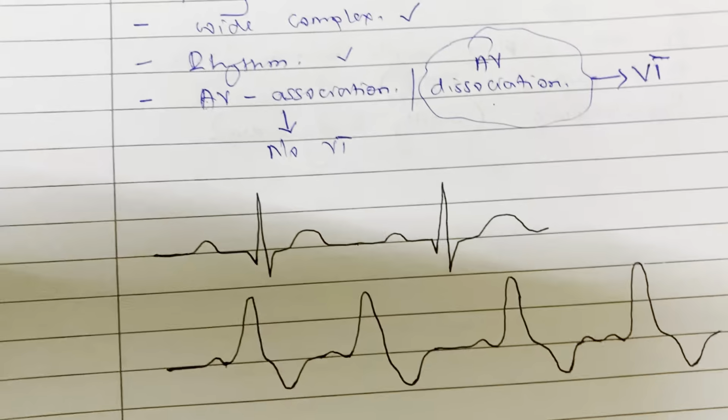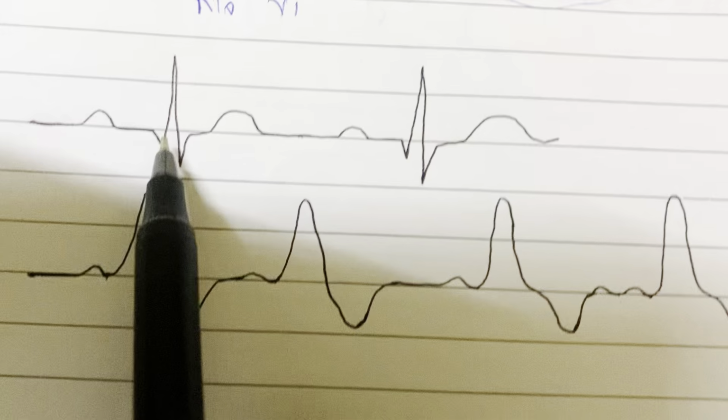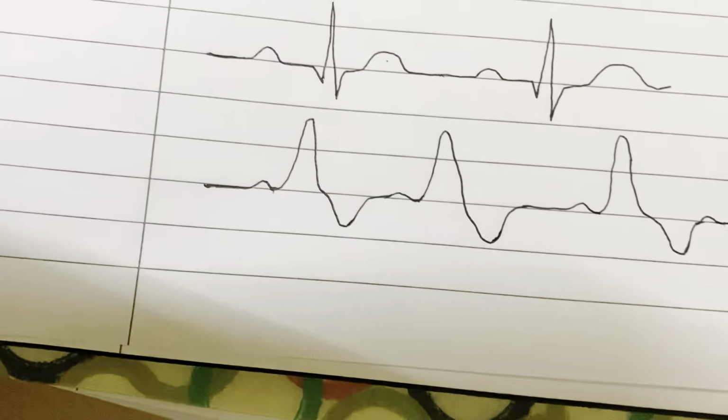So I'm naming these ones. So if you compare these two, they may look different. One, direction of the T wave.